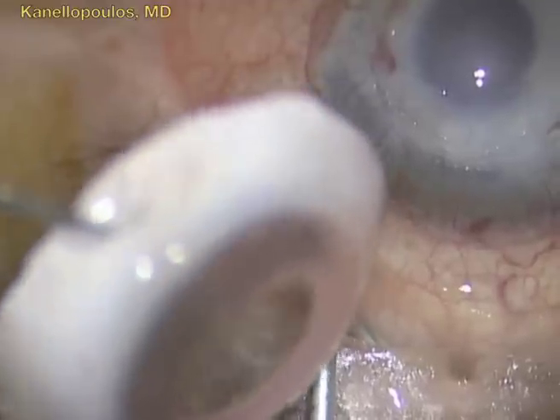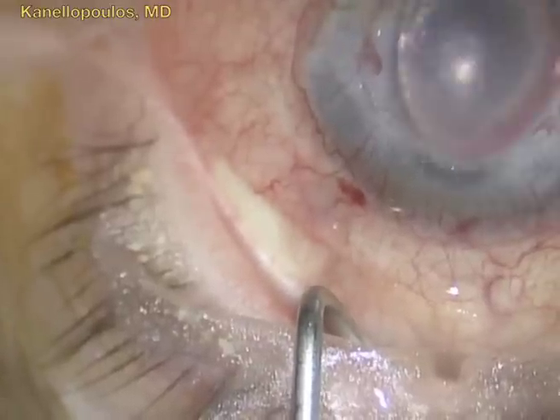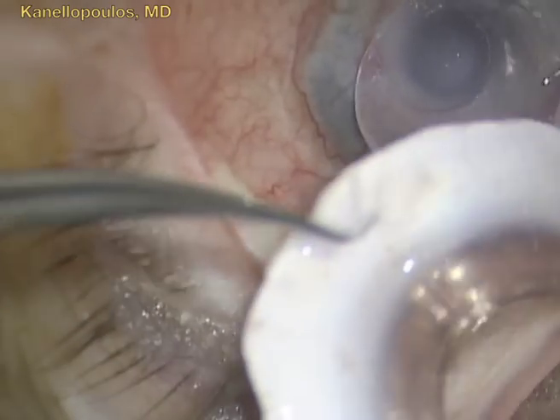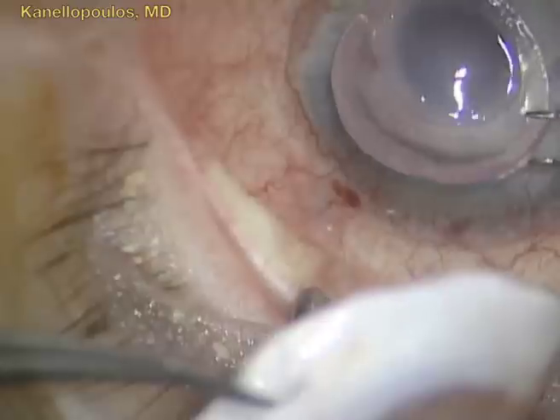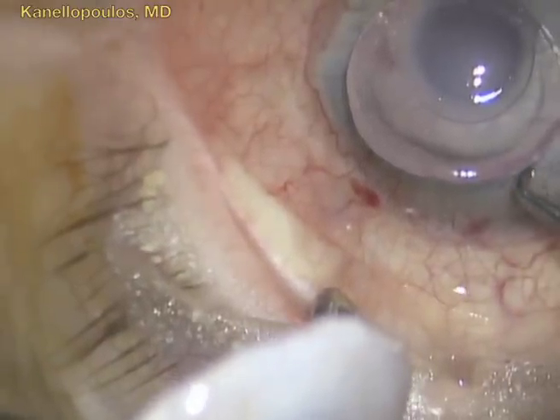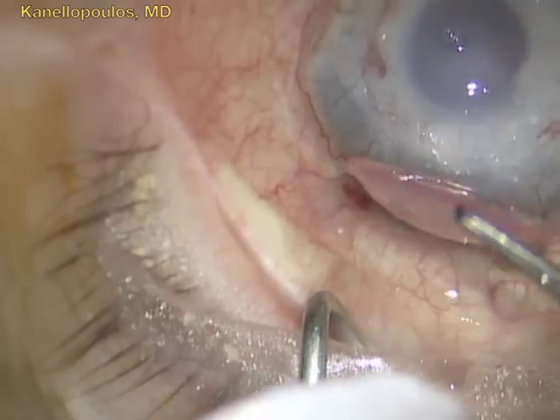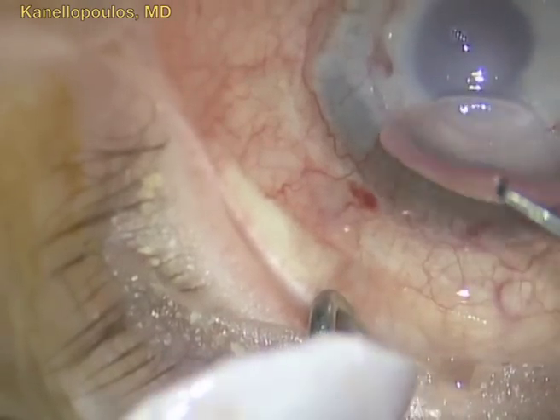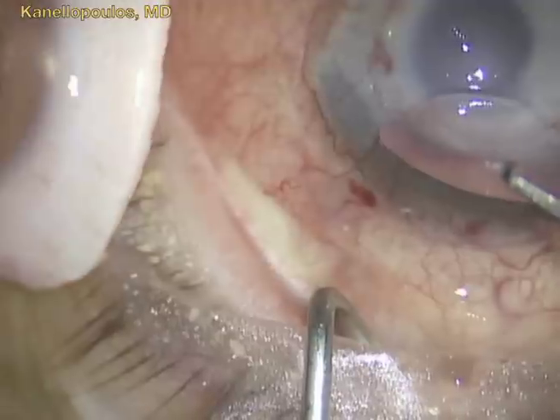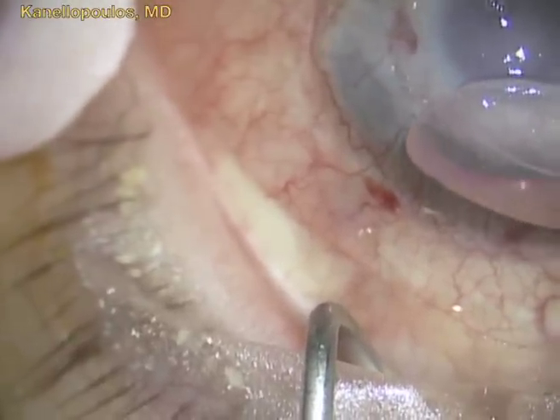We will evaluate this before we open the patient's trefination. Here the cornea is placed upside down just to make sure visually that it matches the parameters we performed. You can see I'm grasping with a 0.12 forceps the edge of the graft, which has a little step, and for demonstration purposes we are making sure that that edge is jagged.